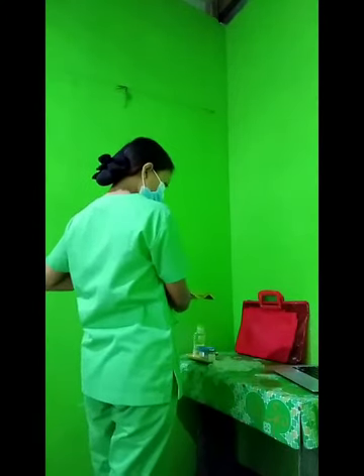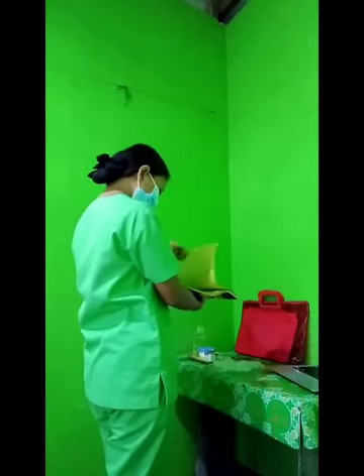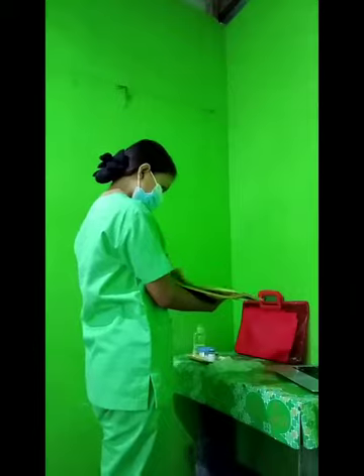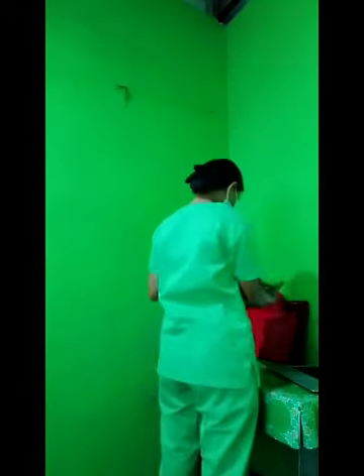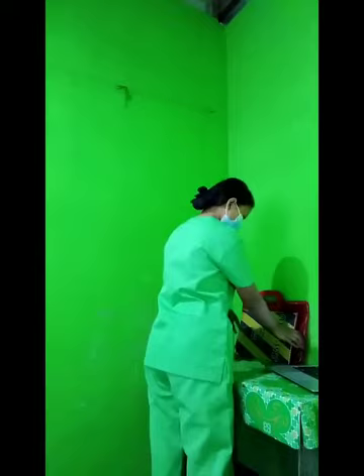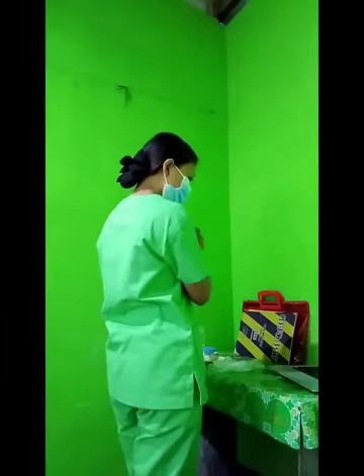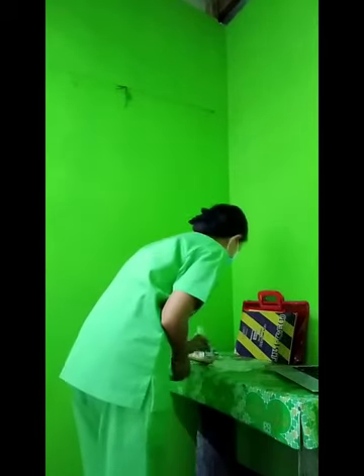Select the proper medication from the patient's medication. Then, check for the expiration date and perform calculations if necessary.